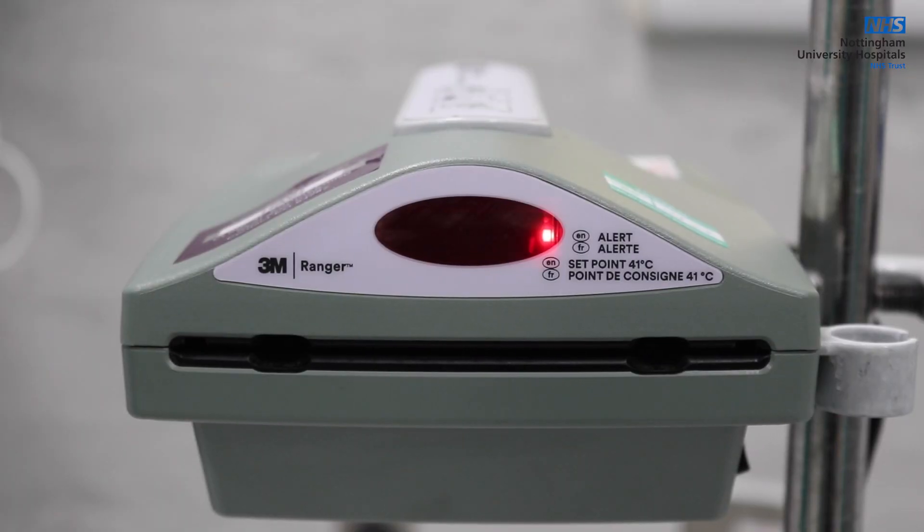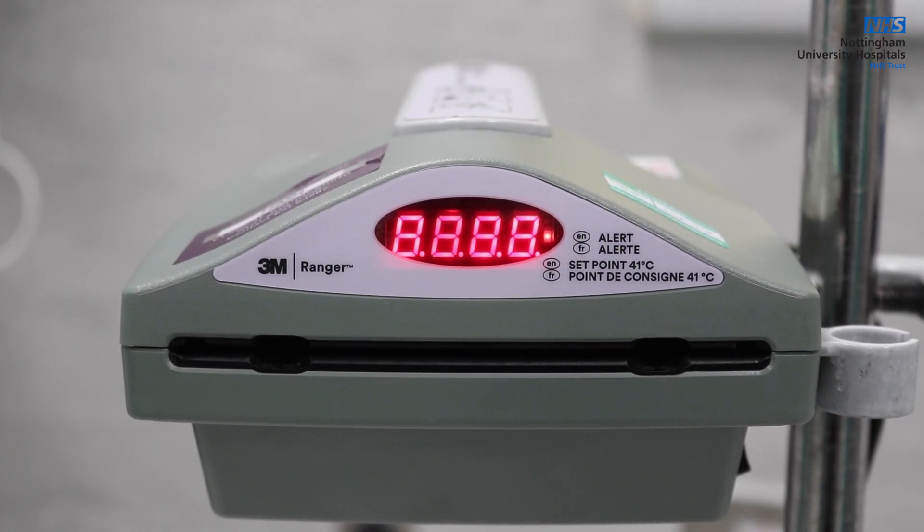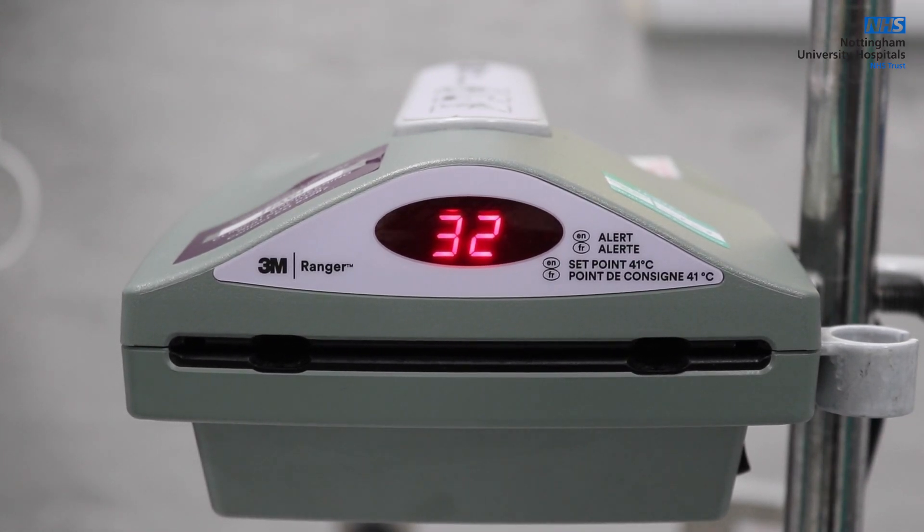Once powered on, the device will run a cell test. This is displayed on the front panel as 88, with a red light illuminated to the side of the display. Once the check is completed, the device will display the current device temperature.